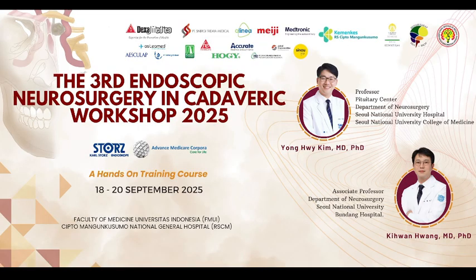And this endoscopic image is a great way to review the key anatomy of the nasal cavity. You can see the superior, middle and inferior concha, as well as the nasal septum and the choana. The vomer is located here, and the sphenoid ostium is at the inferior third of the superior concha. Usually the sphenoid ostium is located 1.5 centimeters from the choana.